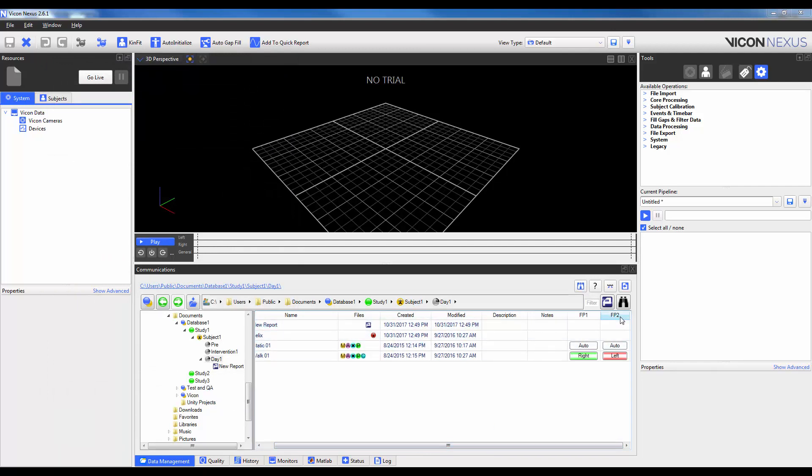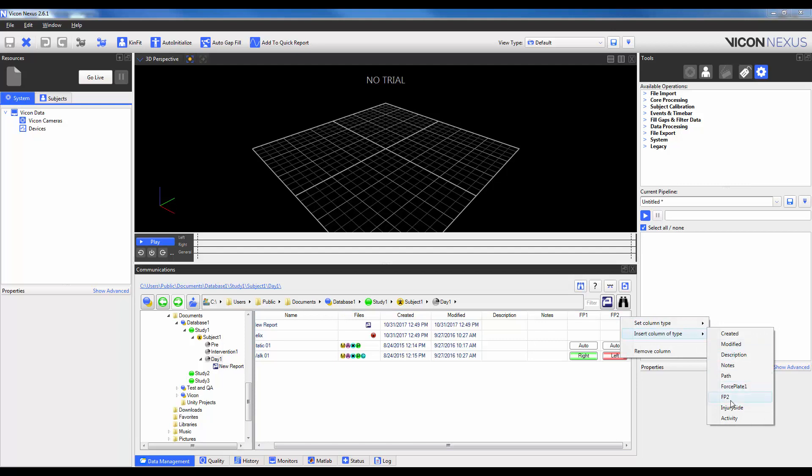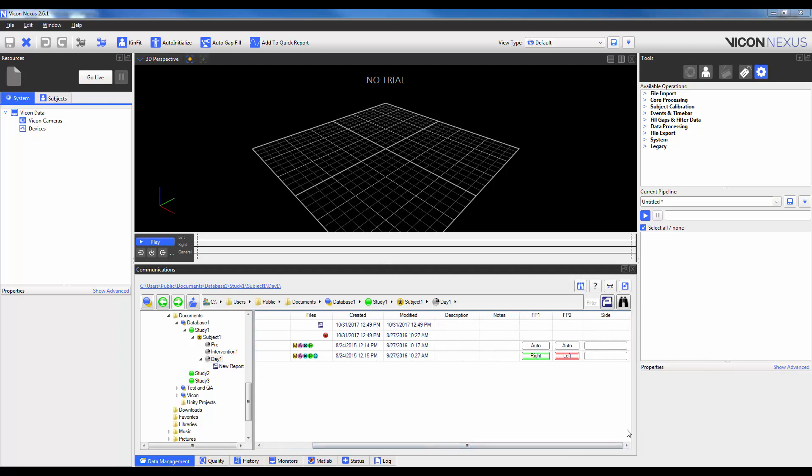I'm going to now right click again on force plate 2 and insert a new column. So you can see here I can add in injury side, but the header text will actually just appear as side. I can then do the same thing. I can right click, insert a column left side, and it's going to be activity.